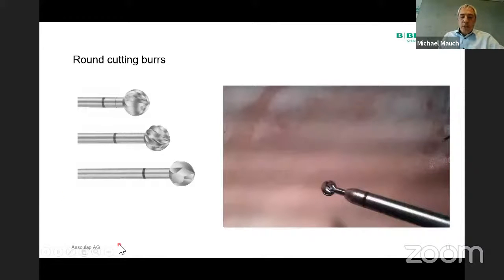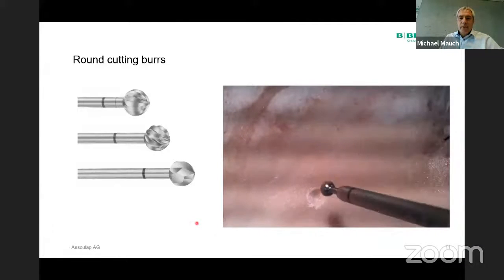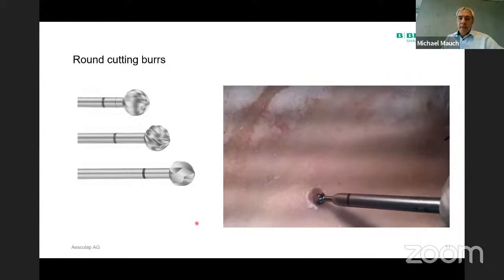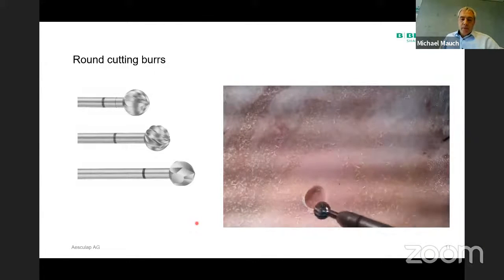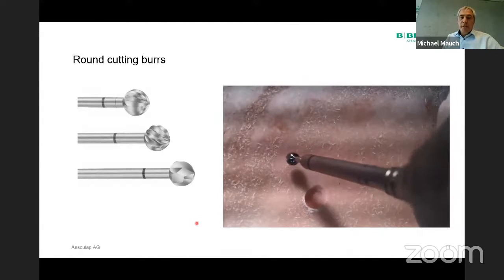So Rosenburrs in general are optimized for lateral cutting. And they have a certain tendency to chatter if you drill frontally into the bone, as you can see here. So you hear that bad noise, so that's dangerous. Therefore you should rather work at an angle of 45 to 90 degrees. Therefore it's much smoother. And by a peeling motion, as you have seen here, you should make the hole always slightly larger than the burr diameter. This avoids that the cutting flutes get in contact with the bone on the full circumference at the same time, because this creates chatter.